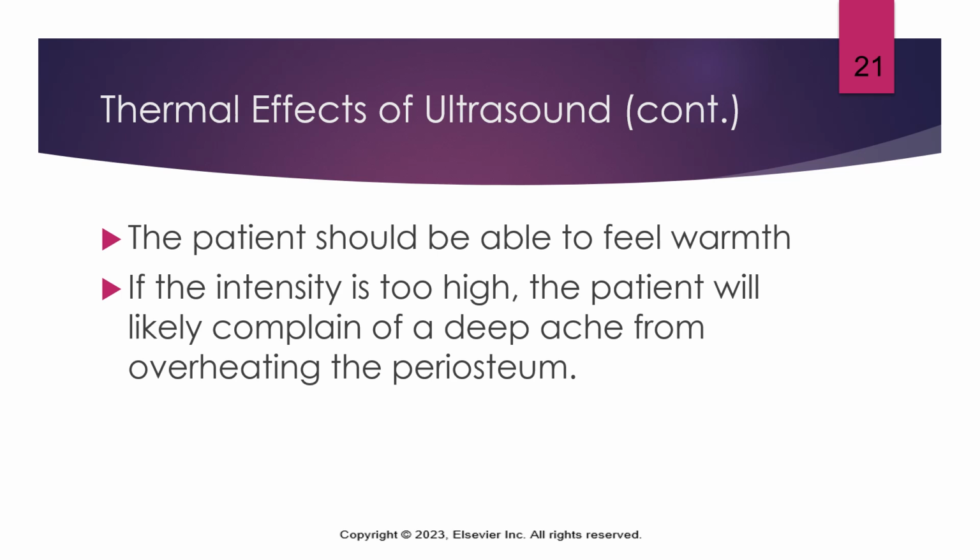So we don't want to burn the bone by increasing the intensity too much or creating those standing waves. Just remember that bone also has a very low specific heat, meaning that it does not take a lot of energy to heat that up. So we have to be cautious.